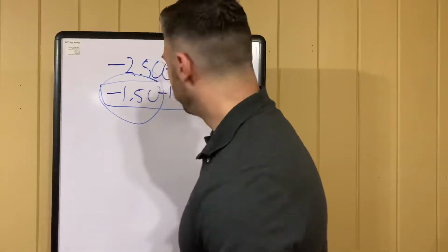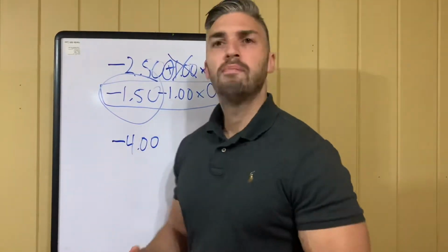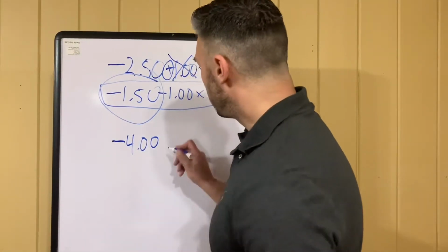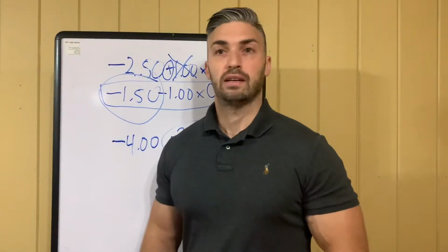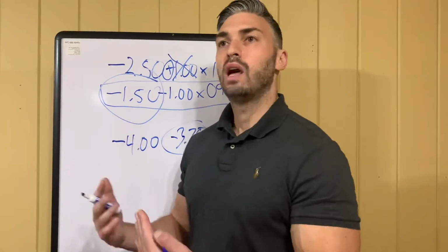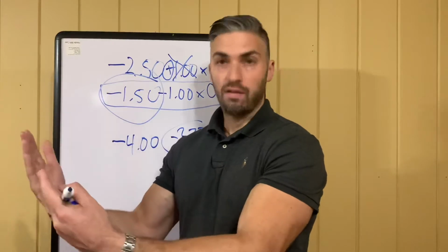For example, commonly, if someone's prescribed a -4 spherical glasses prescription, a lot of times they'll be fit with a -3.75 spherical contact lens because we're making it less minus, more plus, because all lenses behave more plus sitting off of the eye.